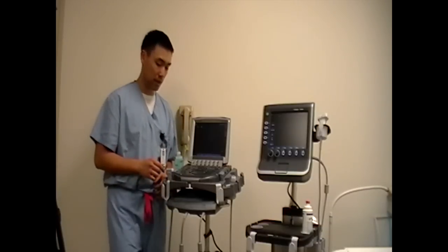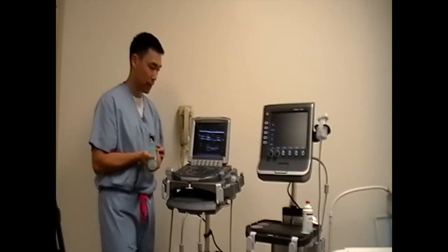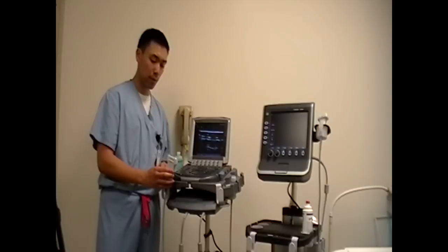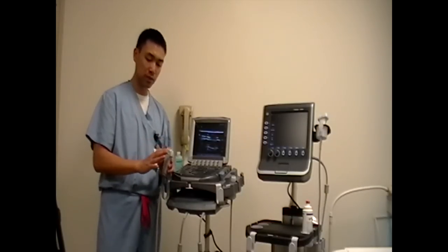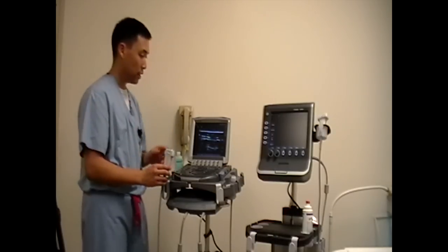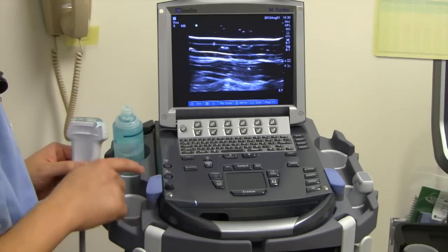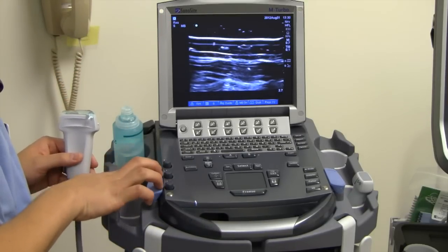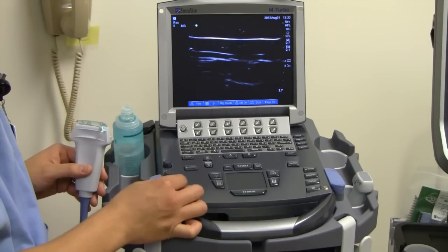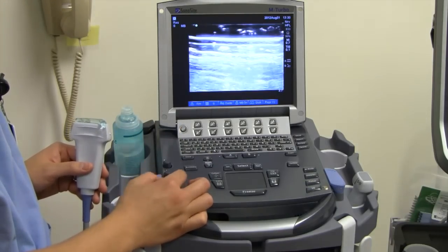The next thing is going to be the gain. Gain is basically how bright you want your picture. I've put some jelly on — the purpose of having ultrasound gel on the probe is that it takes away any air between the probe and the skin, and it helps you see your images. So when you put gel onto an ultrasound probe, this is what you're going to see. The gain is over here on the right side. The bottom-most one is for total gain. When I'm turning down the gain, the whole picture becomes dark, and when I turn up the gain, the whole picture becomes bright.